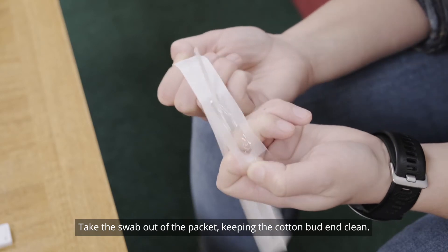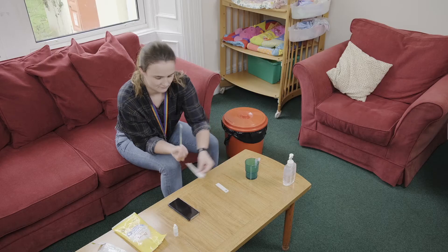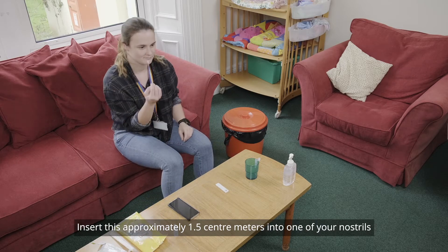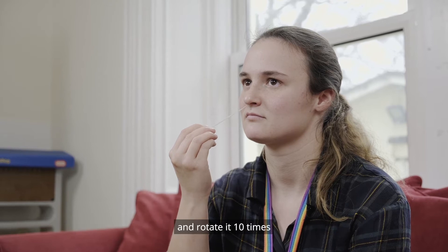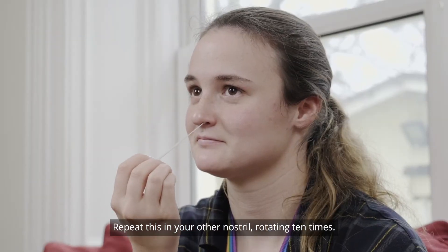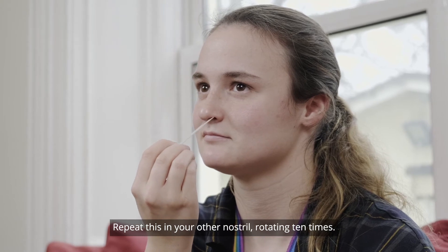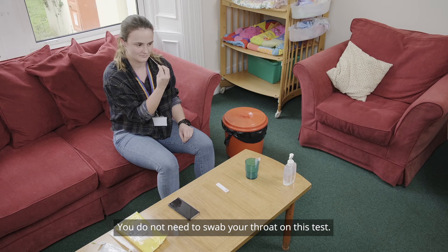Take the swab out of the packet, keeping the cotton bud end clean. Insert this approximately 1.5cm into one of your nostrils and rotate it 10 times. Repeat this in your other nostril, rotating 10 times. You do not need to swab your throat on this test.